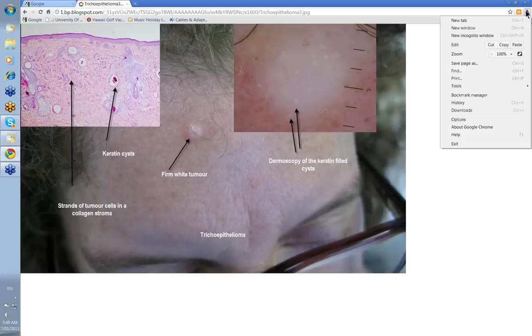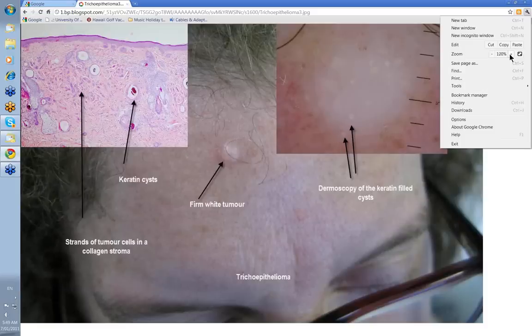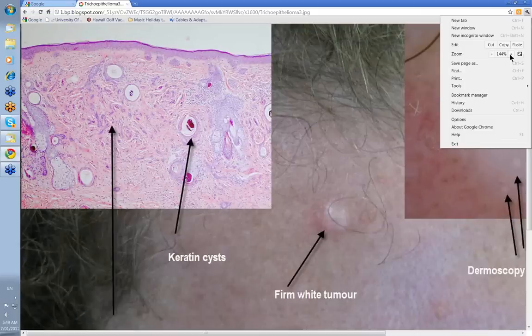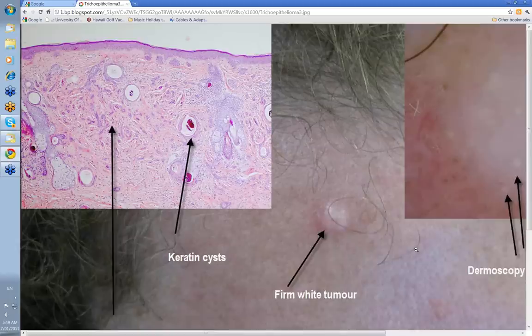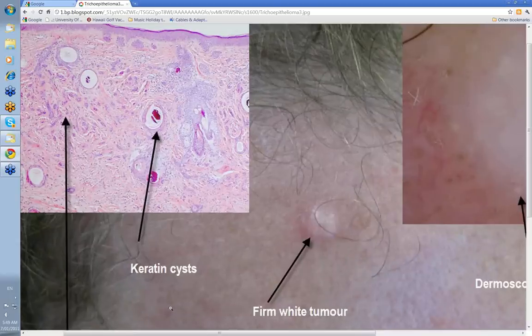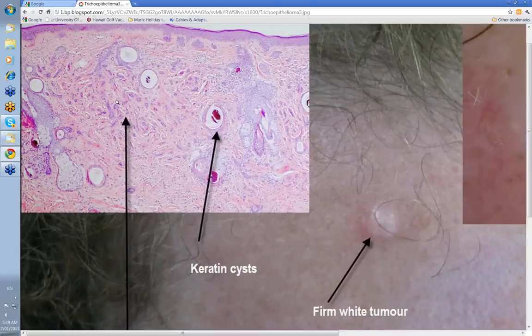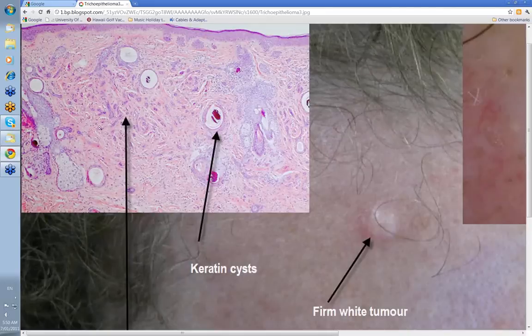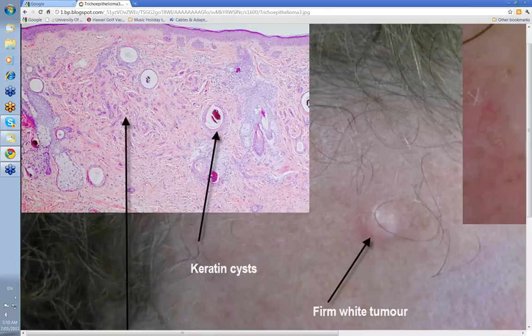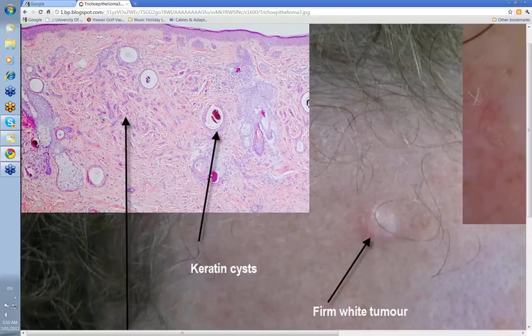Let's make that histology a little bit larger to have a look. These are the strands of cells within a much pinker collagen stroma roundabout. When you get these strands of cells within a collagen background, plus all these keratin-filled cysts, then you're looking at a trichoepithelioma.